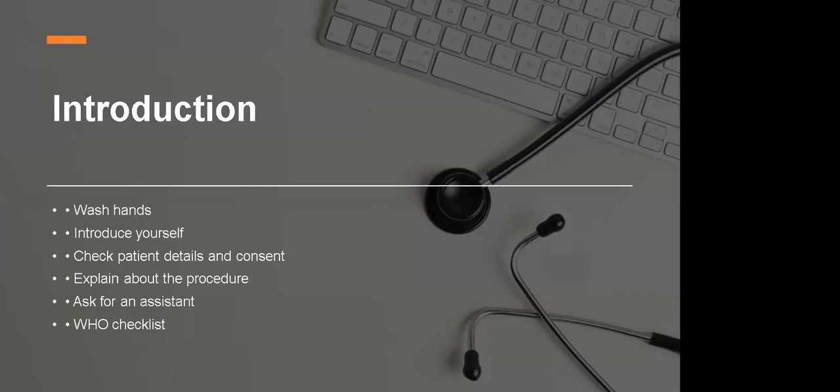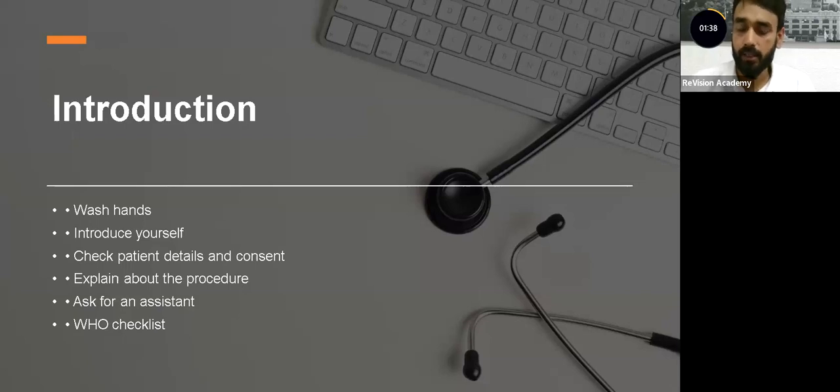For the WHO checklist, you have to check proper patient, proper site, proper position, proper timing, everything. Just check his bracelet or wrist, any point of ID, his name, and match it with his document. So you can offer that: I would like to check the WHO checklist, I mean, patient name, age, details on the bracelet as well as in the document. If you miss the WHO checklist, you lose your mark.